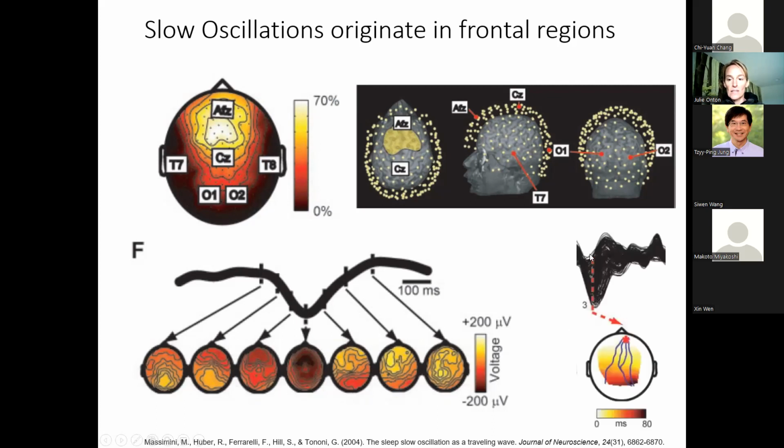This is another display of the same thing, a bunch of channels on the head, and looking at a cross section, you can see that the slow oscillation travels backwards from the origin up in the front of the head towards the back of the head over 80 milliseconds.